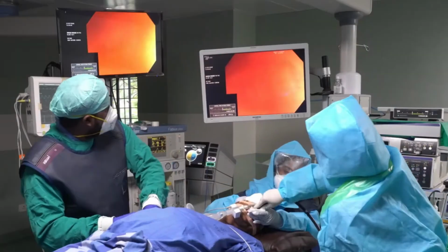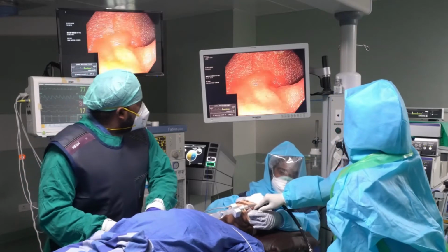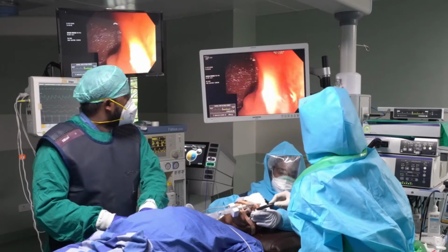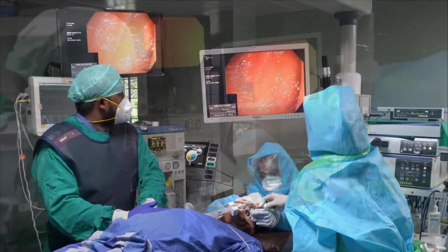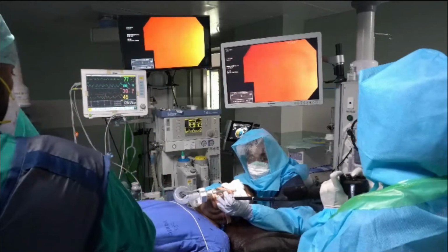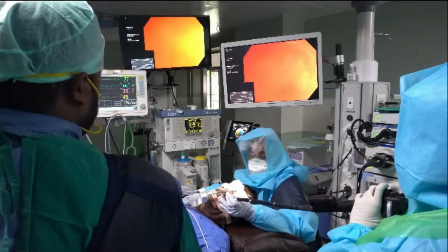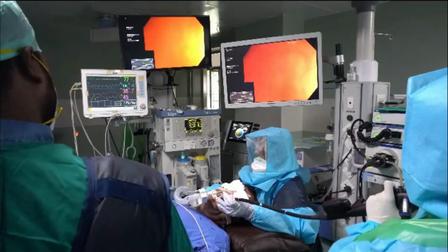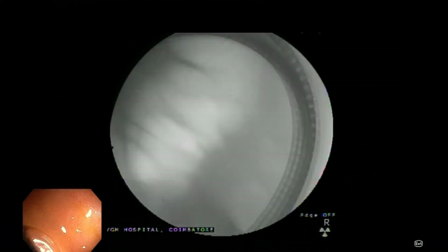In a difficult bend, additionally, the position of the patient can be changed from left lateral to supine. The assistant gives abdominal pressure in all 4 directions to find the right pressure and the right direction to keep the lumen in vision. Reducing the loop by pulling backwards while pressing the forward pedal and abdominal compression helped. When all fails, we may use the back pedal to unpleat a bit before moving forwards. We use fluoroscopy only occasionally, especially when there is no advancement of the enteroscope.